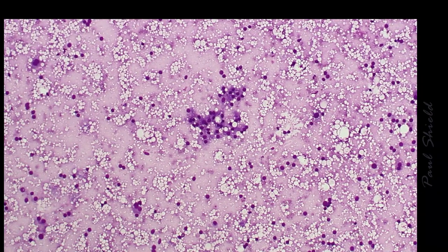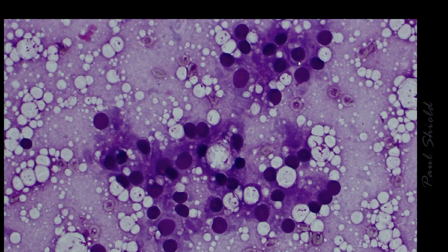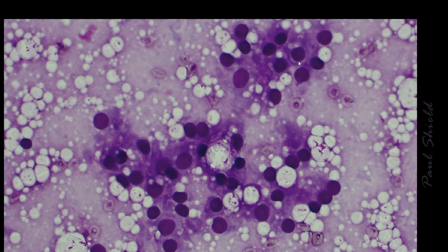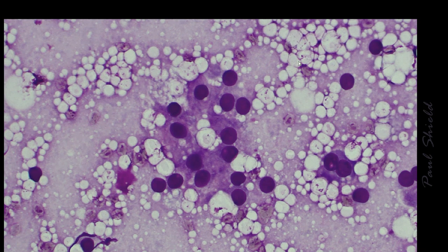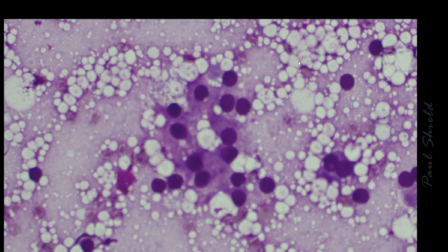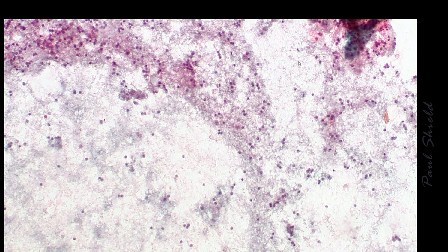Here's some cohesive epithelial cells, hyperplastic cells. Notice they're larger. They've got more abundant cytoplasm than you see in normal ductal cells, and some of it's vacuolated, and fairly large but quite uniform nuclei.